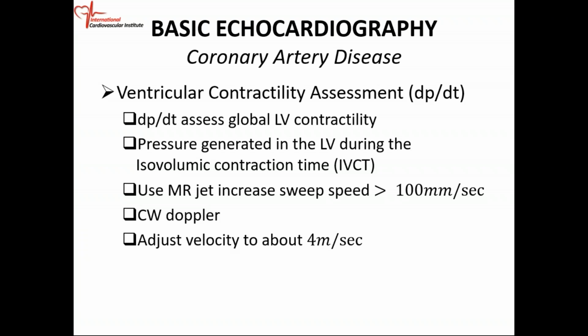Okay, so dP/dt assesses global LV contractility. You can do it on the right side as well, but we're looking at the left side right now. So it assesses the global LV contractility. And as mentioned before, it's the pressure generated in the LV during the isovolumic contraction time, IVCT.